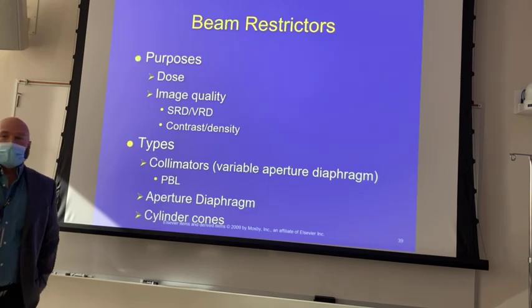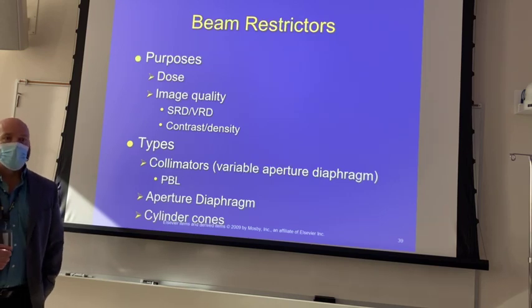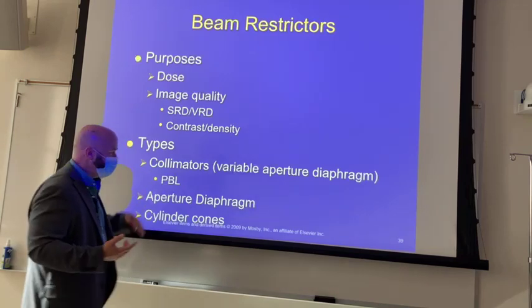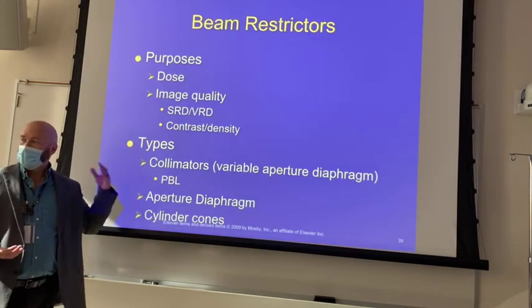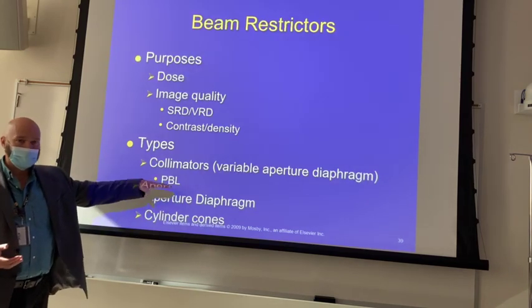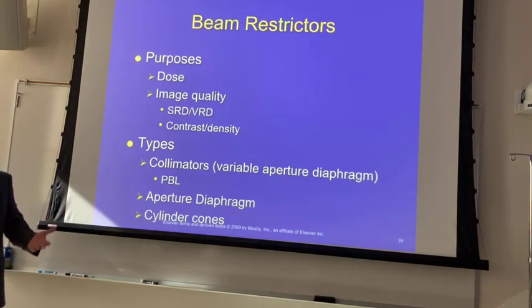The reason you don't see it anymore is because how many different image receptor sizes do you see in clinicals now? One, right? Just one. So it doesn't really apply anymore, but it was law for a number of years that any time you bought a new piece of equipment it had to have positive beam limitation in it. So that was to keep from overexposing the patient.